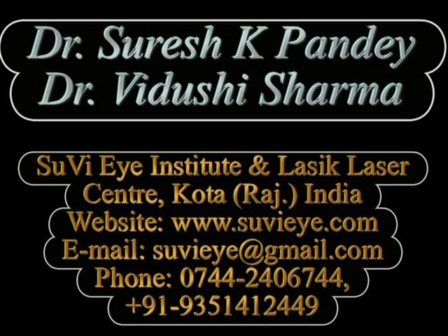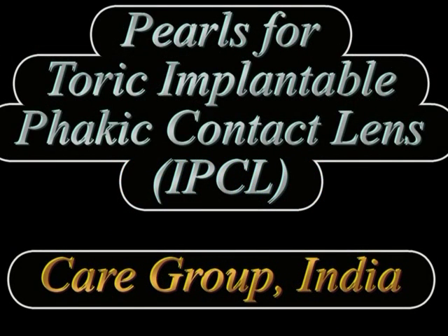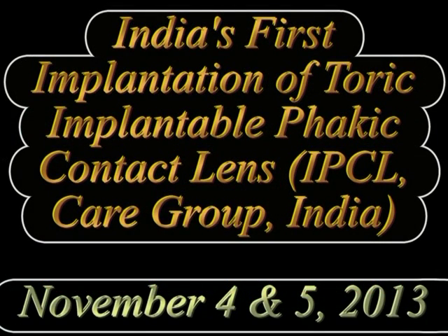Hi, I am Dr. Vidushree from Suviyeye Hospital, Kota, Rajasthan. In this video we describe the technique of implantation of a toric IPCL, or implantable phakic contact lens, which has recently been launched by the Care Group in India. The case shown here was the first implantation of a toric IPCL in India by the Care Group.